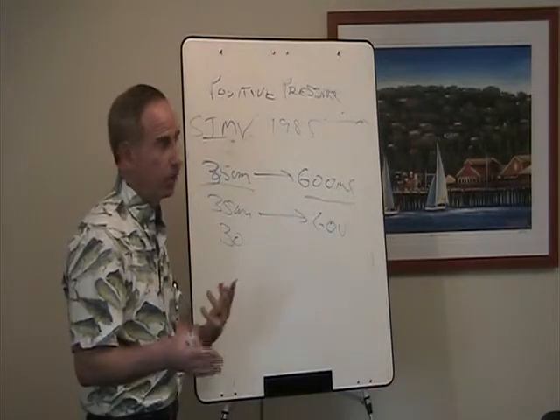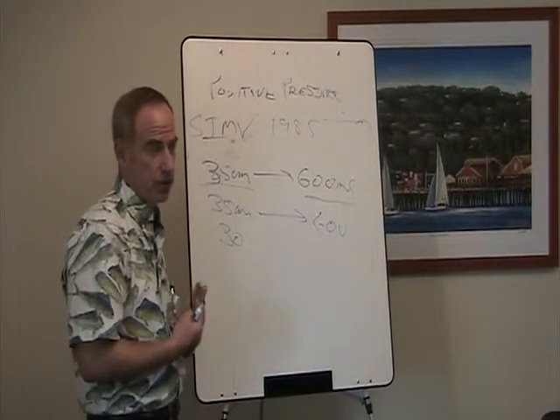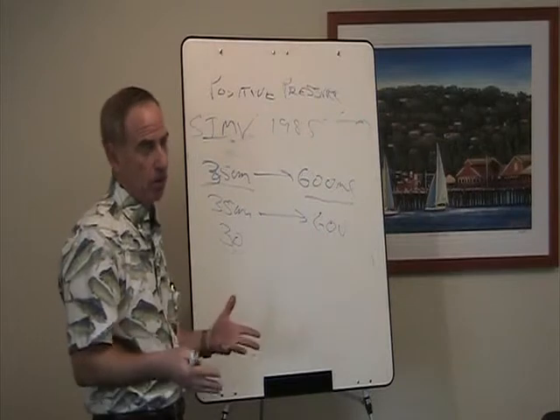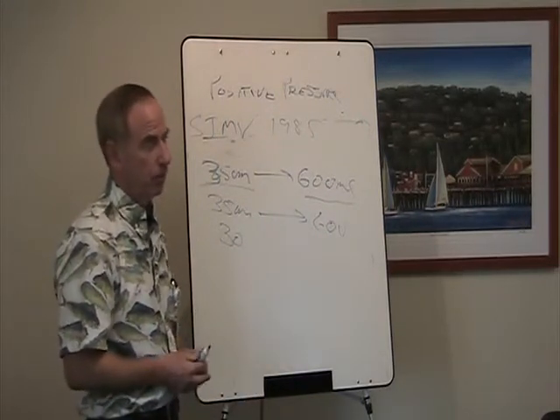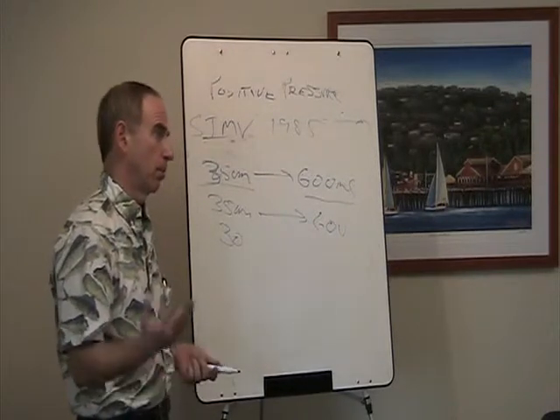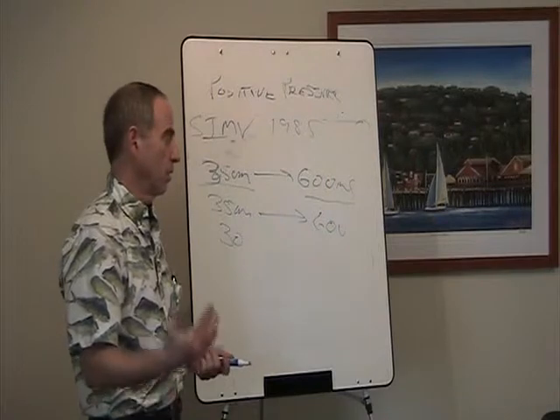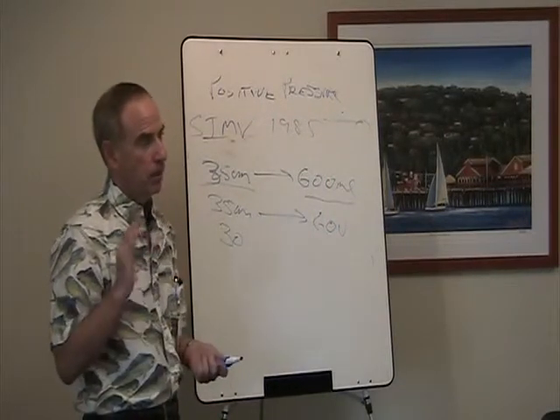A lot of the newer modes of ventilation, bi-level and airway pressure release ventilation, are pressure modes of ventilation. You're not really dialing in a volume, you're dialing in a pressure. I don't really have time to talk about those modes. Those are newer modes. They are useful. Probably you should have a pulmonologist or an intensivist helping you manage those patients. So I'm not going to go into those right now. We can have another talk on that if you want.